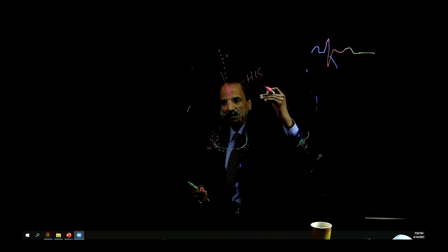So telling you, look ahead, look higher. And which arrhythmia will you need to look higher, and yet you can have more V than A? So you think AV node reentry, you think of a junctional, high junctional tachycardia, maybe nodoventricular tachycardia. So then we look at which beats we can understand, focused on that and did the ablation.